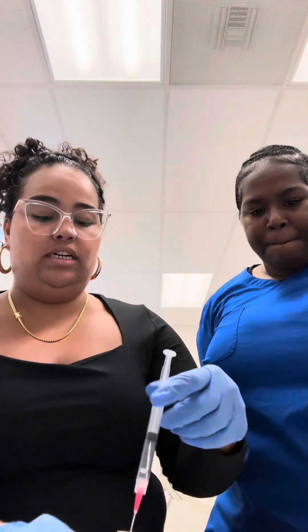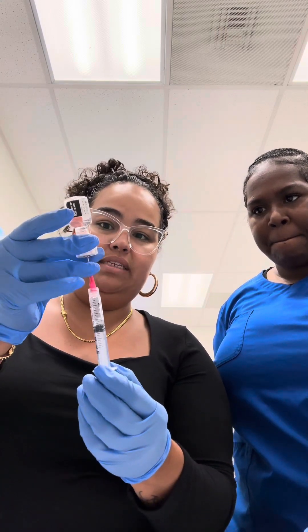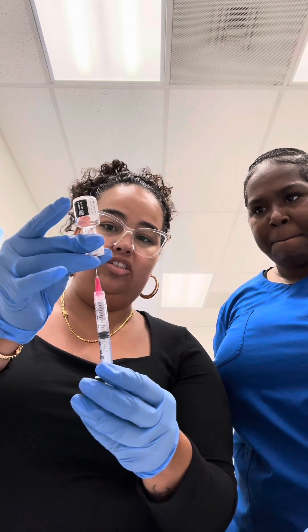Alcohol wipe your vials. These are a little tricky, so anytime you're drawing up medications, whatever you're drawing up, you put air in first — so 1cc of air. Leave your vial down, go right into the center. It actually has a little image on here where you can see the little stopper in the middle. Go right into the center and push the pressure in there, because it reduces the bubbles and makes it easier to draw up your meds. You see it naturally retracts.